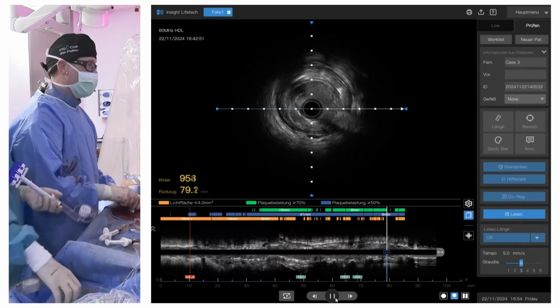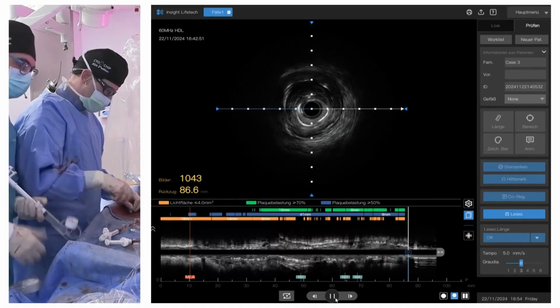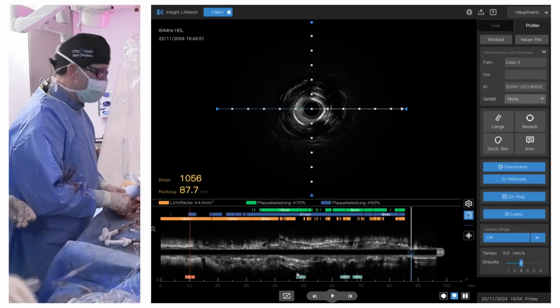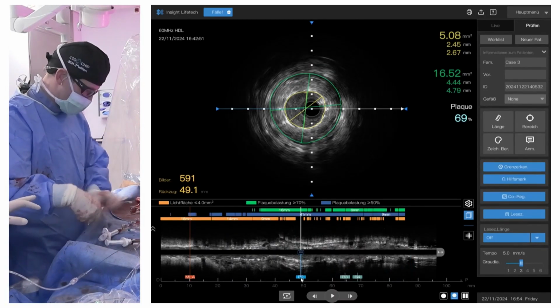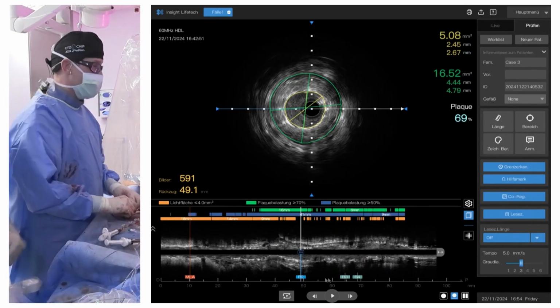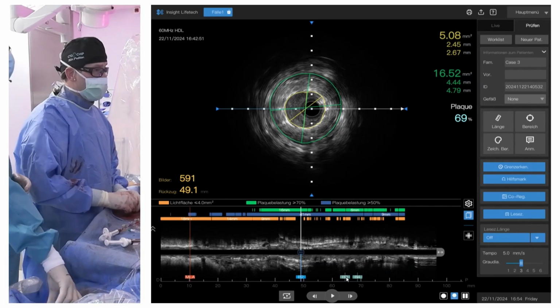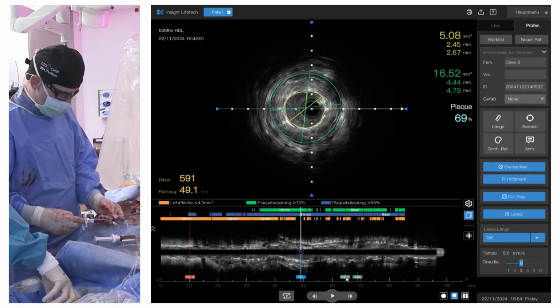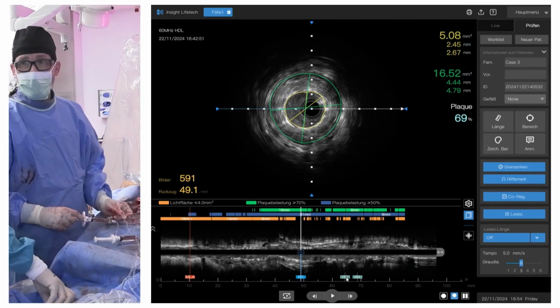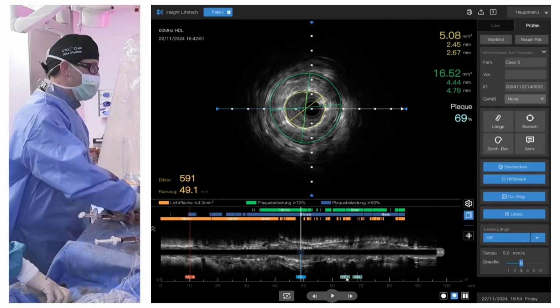The additional thing is we still have the occlusion. So we dilated with 3.0 now. We still have the occlusion of the PD. But we have a dual lumen catheter still on the shelf, and so we're gonna try to open that one up. I might show you an angio. It's all stented anyway.